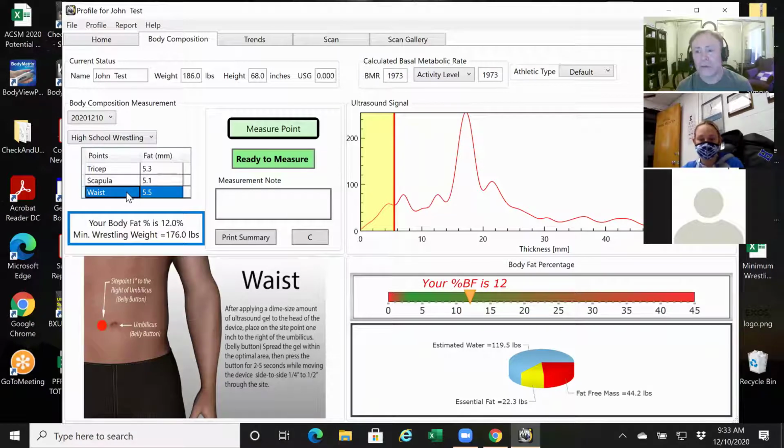Right away, again, red flag, right? For two reasons. A, 5.5. I'd be a happy kid. But reality is, in my case, you know that Mr. Test here is certainly carrying excess fat. There's no way that he's sub 10. So 5.5 smacks of somebody that's really lean. So you know right away, can't be.